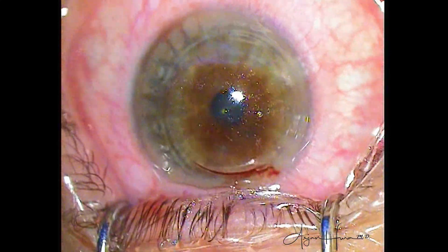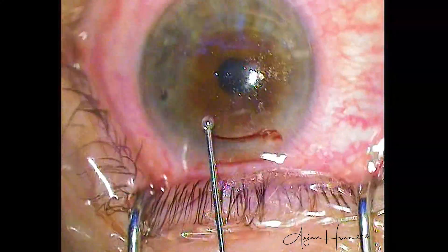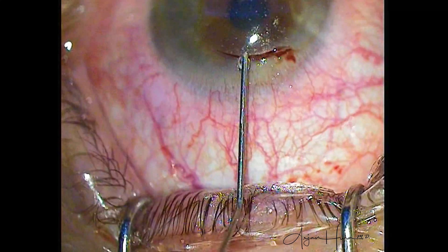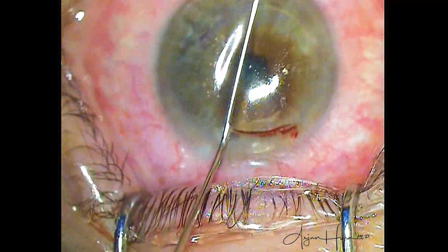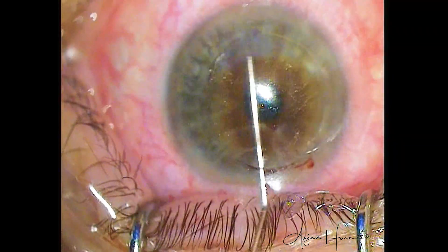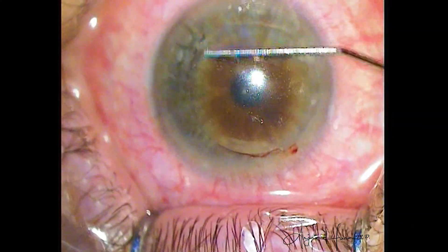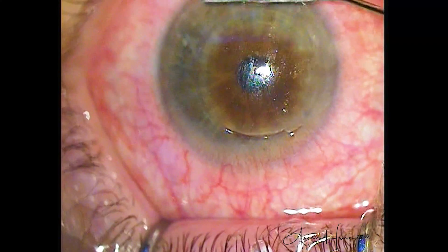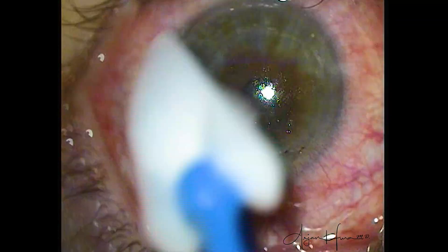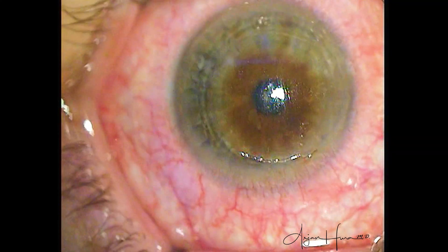It's great that the lenticule came out all in one piece, but we can't just leave the blood in the interface. So I'm going in here with an irrigation cannula and gently irrigating out all the red blood cells to make sure they don't stay in the pocket. A little bit of blood left in the SMILE interface is most likely going to get absorbed on its own, but red blood cells in the SMILE interface can be a risk factor for developing inflammation or even DLK — diffuse lamellar keratitis. I squeegeed out all the fluid and I'm now taking Wex-cel sponges to smooth everything out nicely.